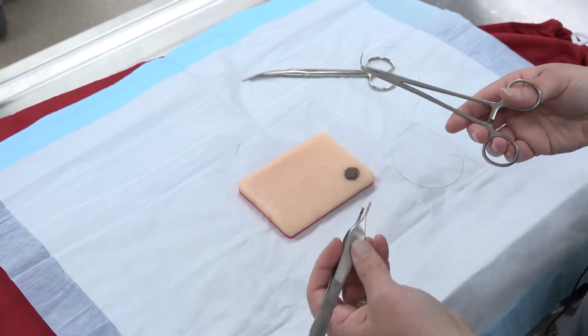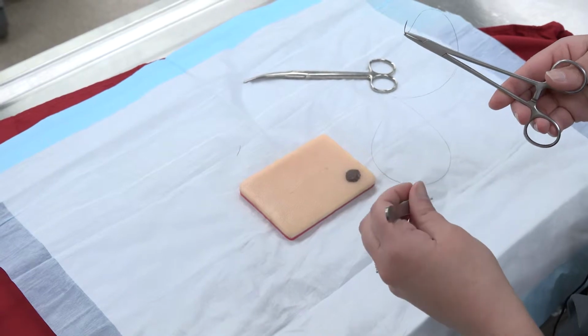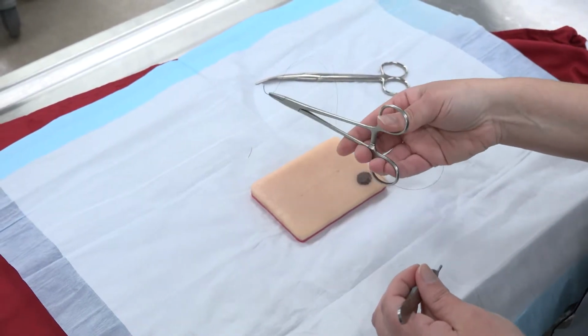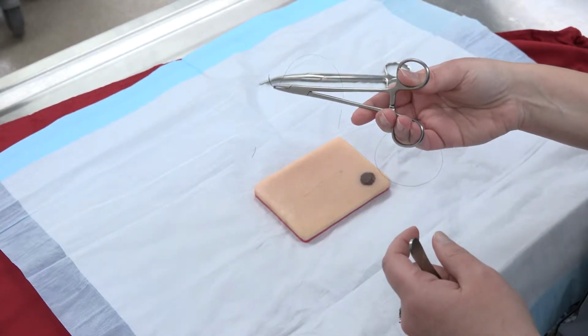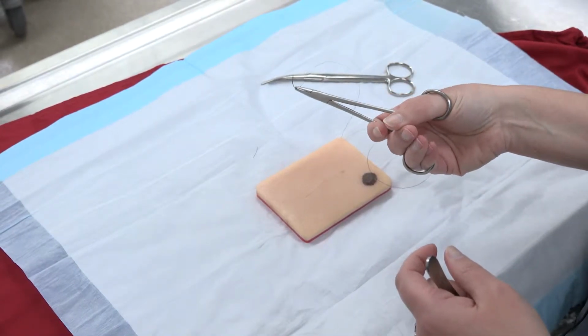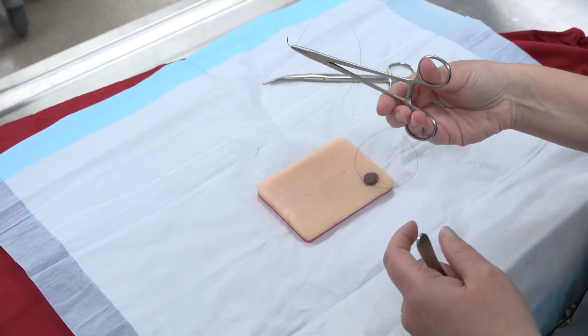Okay, I'm just going to give you a couple tips and tricks for a subcuticular pattern, because that is one of the hardest patterns that there are. First thing is how you're holding your instrument. You need to be out on the tips of your fingers, okay? And if you're having a hard time holding it like this and you really want to put it up like that, you really need to work on having it in your fingertips.